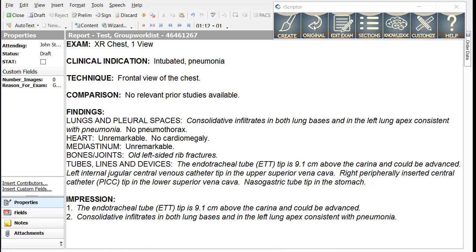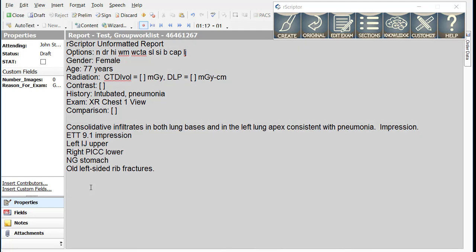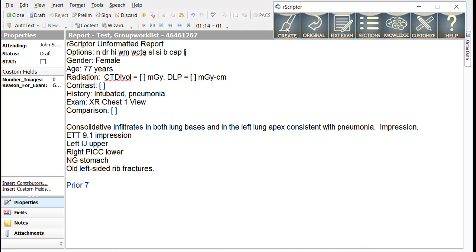Now let's go back to our original report and note that I could easily dictate a comparison study into this comparison section of the report. Instead, I'm going to use a smart macro that we designed for comparisons where I can simply dictate prior seven. What that means is that there is a prior comparison study that's the same as the current study in X-ray that was done on the seventh of the current or prior month, whichever is closer. When I create this report, you can see that the comparison study and date is placed in the report.